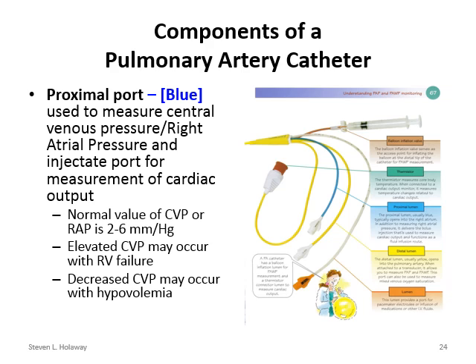Typically, if we're looking at a low CVP, which is measured from the blue port, we're looking at hypovolemia. We're looking at fluid status. That's usually what we're seeing with that measurement on those patients. So remember, CVP really looks at fluid volume on your patient. Fluid volume.